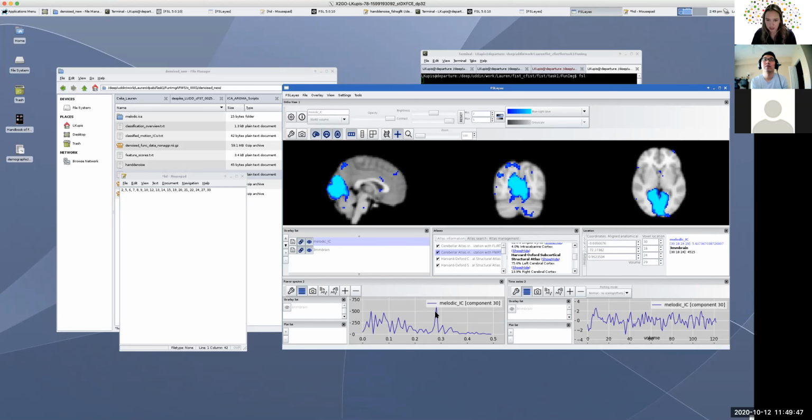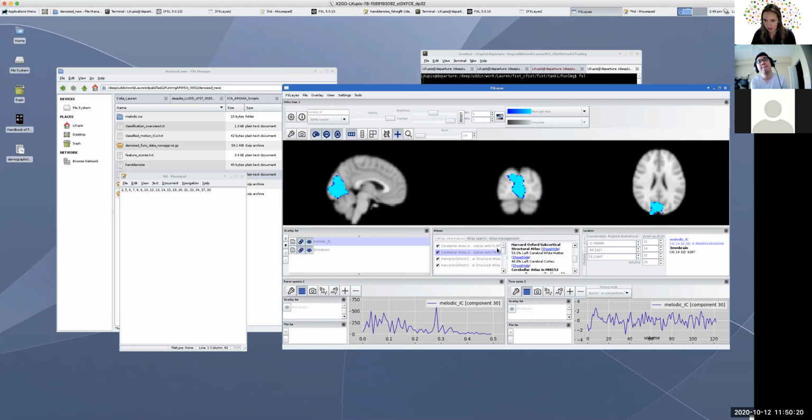Okay, and this one, it's a pretty big spike over here. So I'm probably already thinking that this is potentially noise, but it does have some peaks over here. So we just want to double check. So I might want to zoom in on this one. Cortex. Matter.